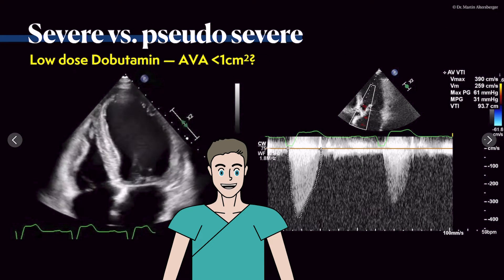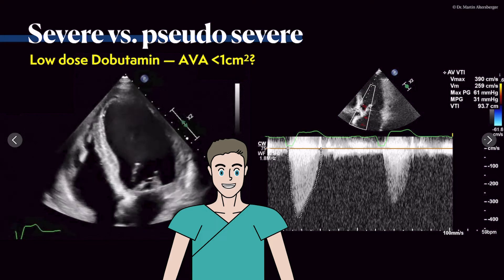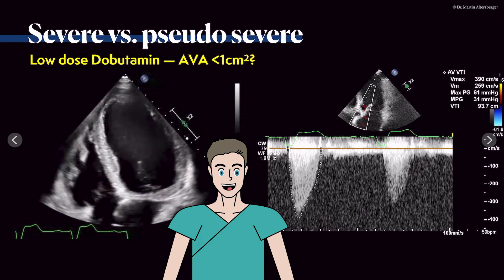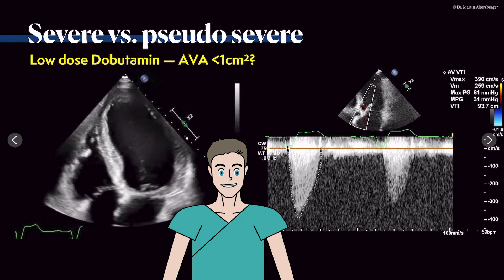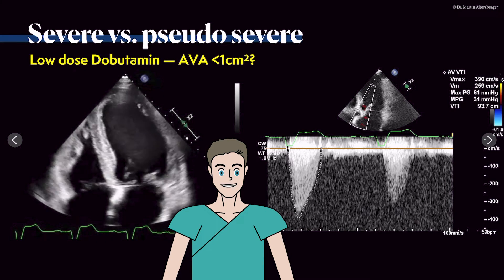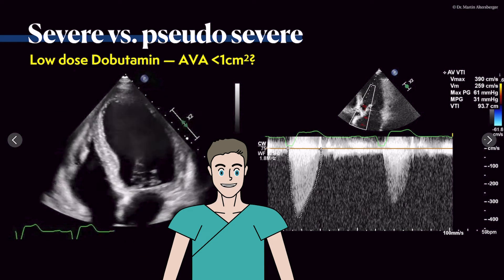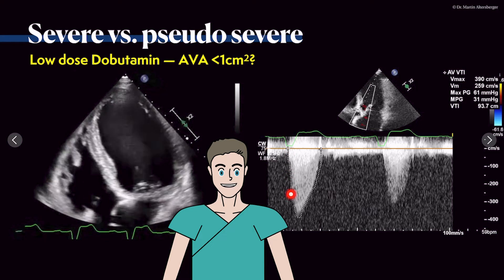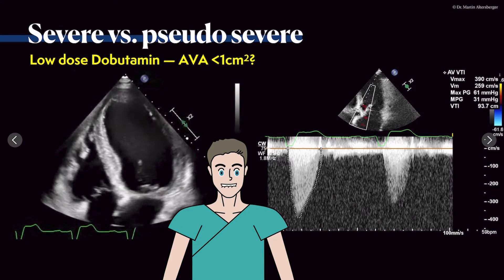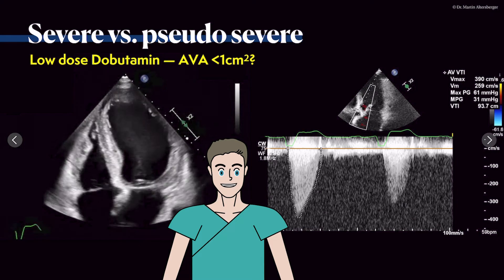Another important term in the evaluation of aortic stenosis is severe versus pseudo-severe aortic stenosis. In this example, we have reduced left ventricular function with a left bundle branch block, approximately 30–35% ejection fraction, and probable wall motion abnormalities. The Doppler signal shows a maximum velocity of 3.9 meters per second, a mean pressure gradient of 31 mmHg, but the aortic valve area was below one square centimeter.